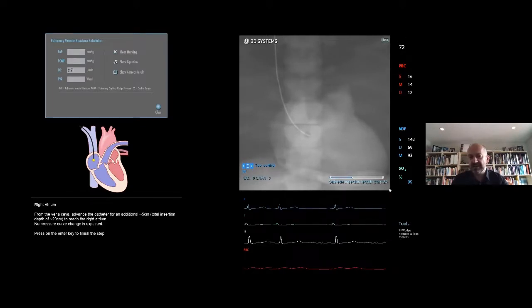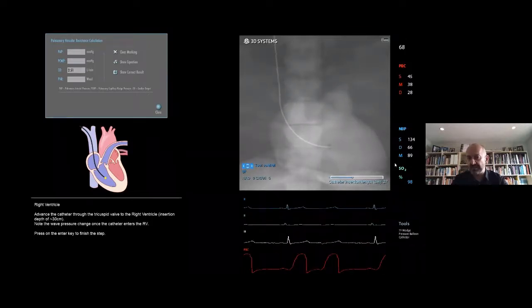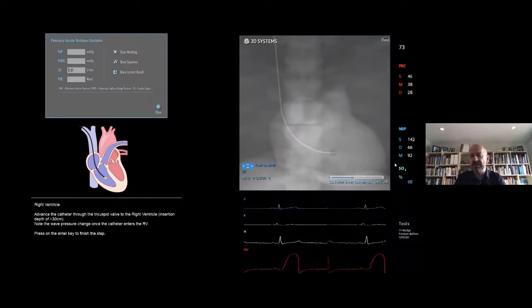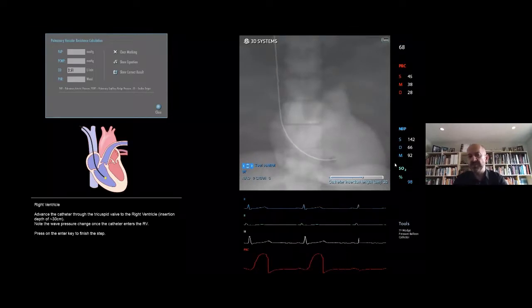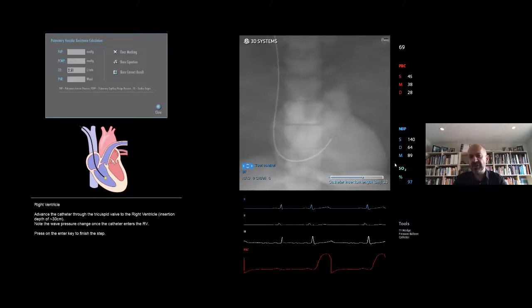This is the time to get into the right ventricle, right? So you just push the catheter in, and it will go in. What you saw on that model of the Swan is they come with a preformed, pre-shaped tip, and that tip looks like a little bit of a J. When you start putting it in from the neck, make sure you turn it in the right direction and position it so that your J is in the direction of the heart.